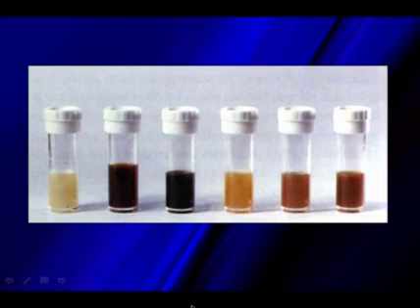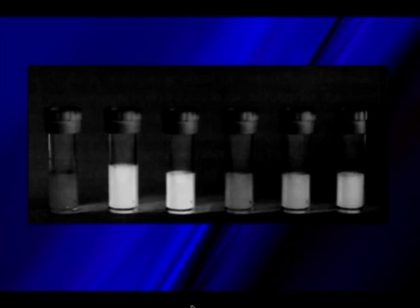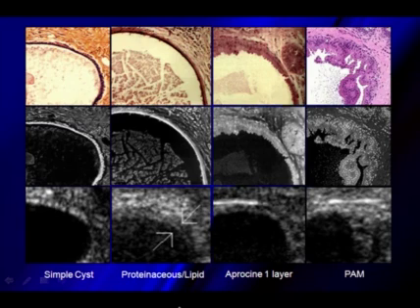Now, if you aspirate breast cysts, the fluid that comes out isn't just a clear serous fluid. These were all just examples of aspirations from different breast cysts. If we video invert those, you can see the different echogenicities that we'll see within this fluid. And now you have an understanding of why we see the echoes that we do in the breast cysts when we're scanning.